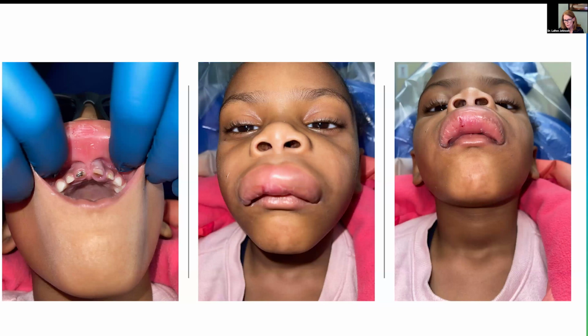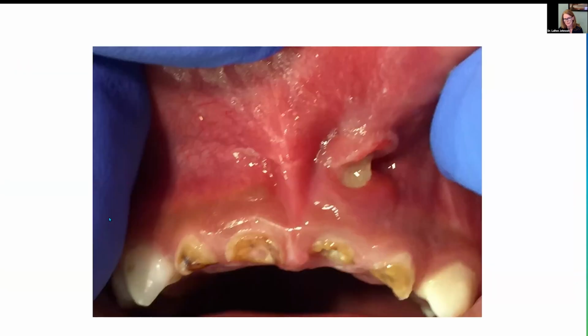And I would approach through the palatal so that the bone that's intact on the palatal aspect can allow the diffusion of that solution and really start making things happen before we get into the other area. And this is definitely a situation where after I got really good release and diffusion on the palatal, the last thing I would probably do is come in from the buccal. And these are two individually terribly infected teeth, and I would try to go right down the midline and get them, and that's the way to approach it.